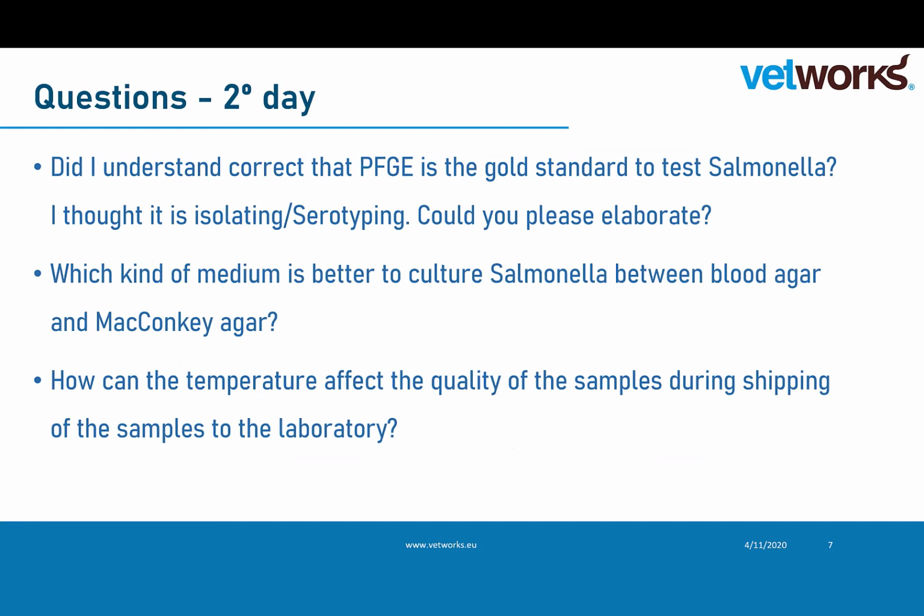I think there was a little bit of a misunderstanding here. PFGE is the gold standard for typing of Salmonella, not for testing Salmonella. To test if Salmonella is positive or not, the gold standard is the procedure that I mentioned, with the pre-enrichment phase and the enrichment phase. But for typing, PFGE is the gold standard.